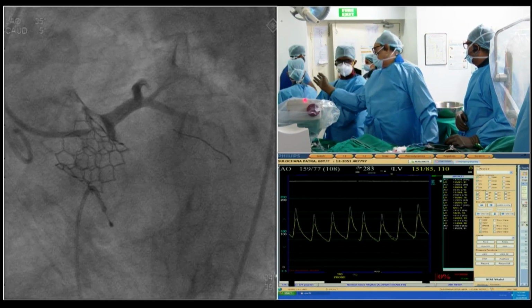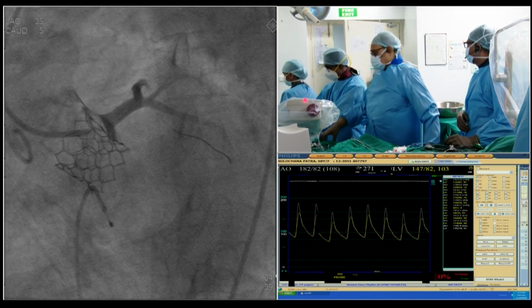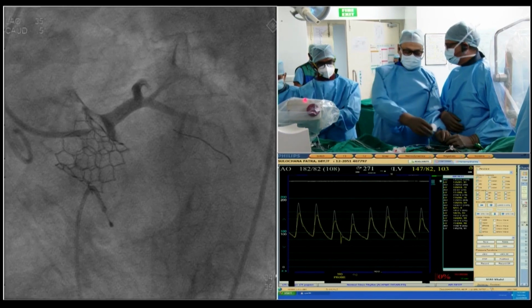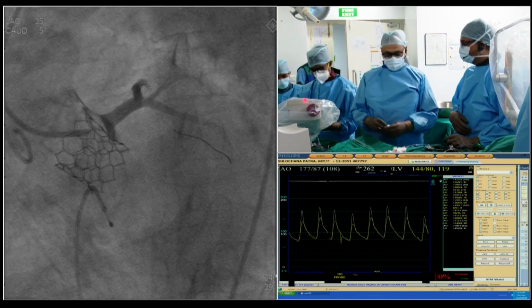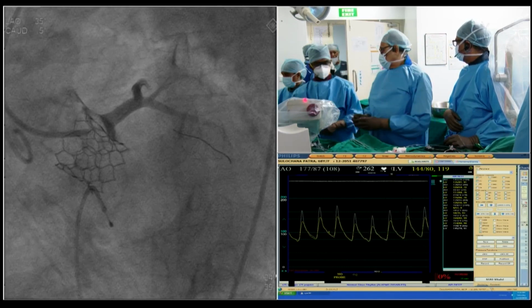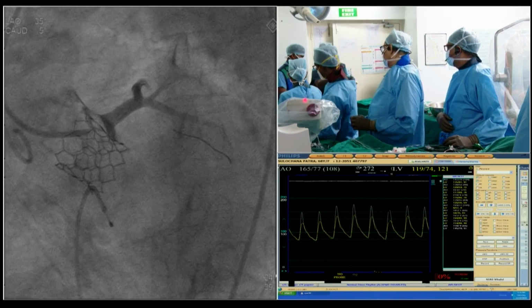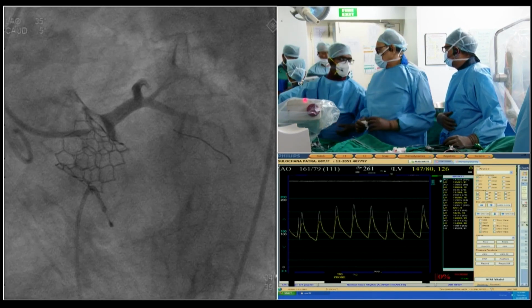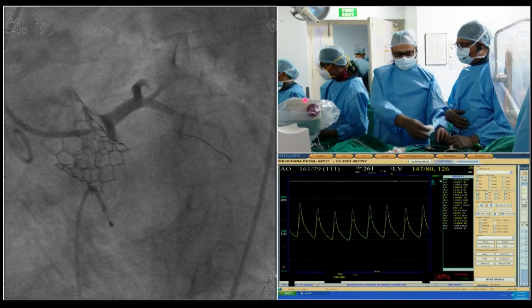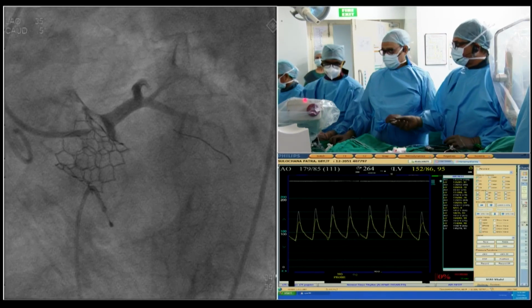Yeah, they're looking for 5.0 if preferable, if not 4.5. 4.9 also is okay. Yeah, 4.9 also is okay. You have 6 millimeters, right? No, no. Only balloons, right? Nobody uses it, so. Yeah. 5.12, sir. Okay. It should be right. Yeah, 5.12 is fine. Yes. We have 5.12 as the next size that we have.